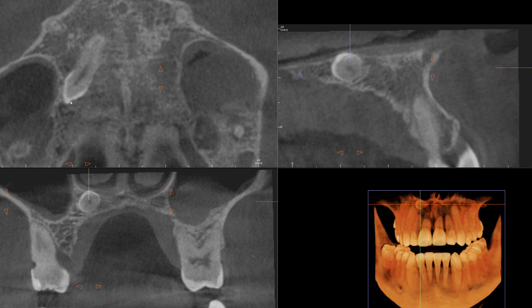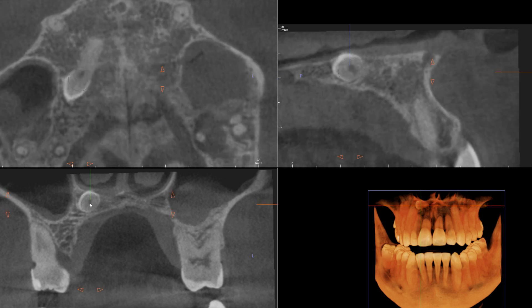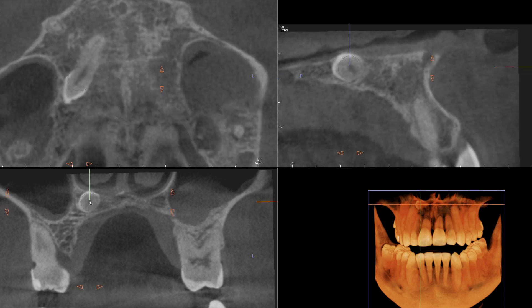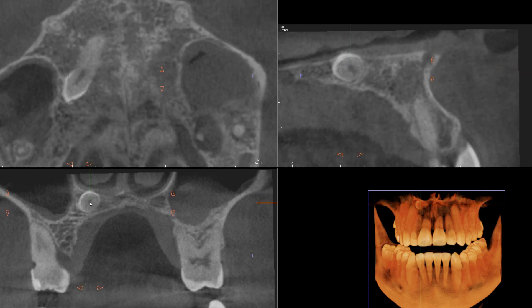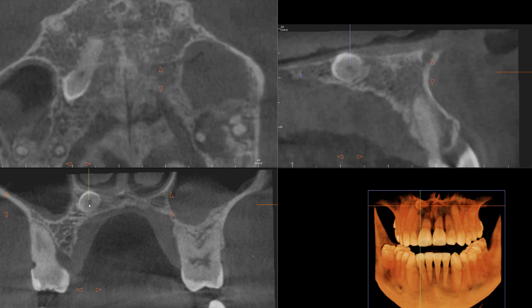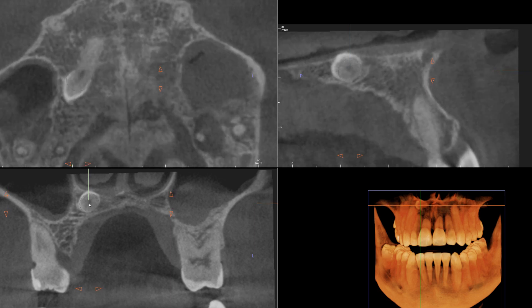Particularly, I'm looking at this area — pay close attention to that. There's almost an interruption of the enamel layer, and it's relatively obvious that it has lost its follicular space.